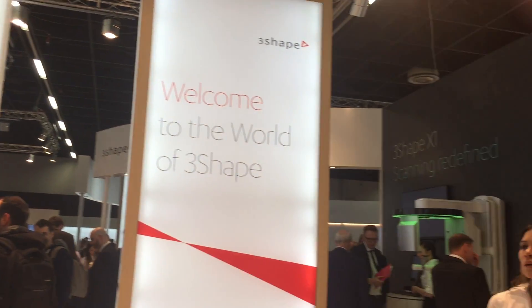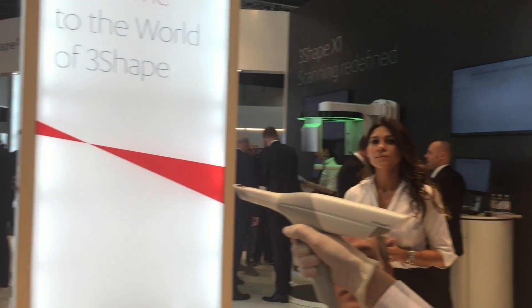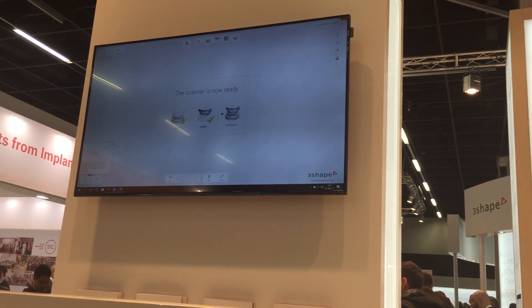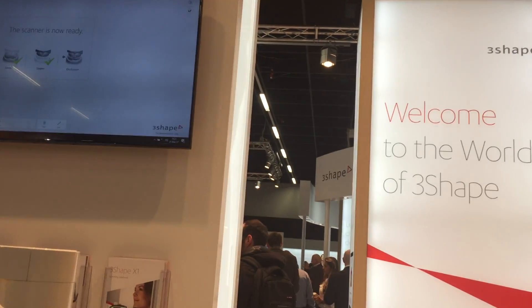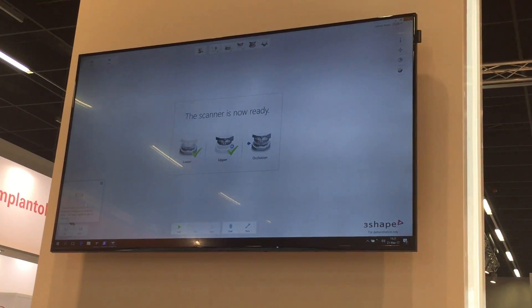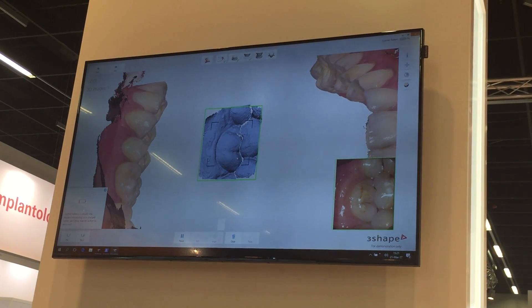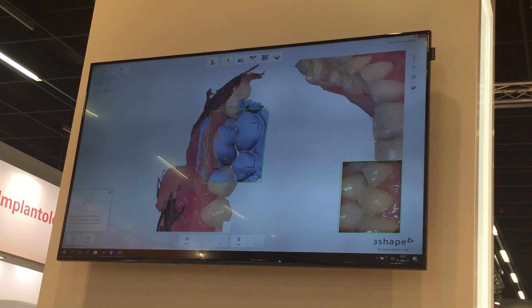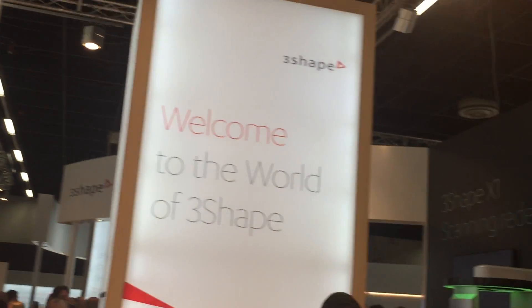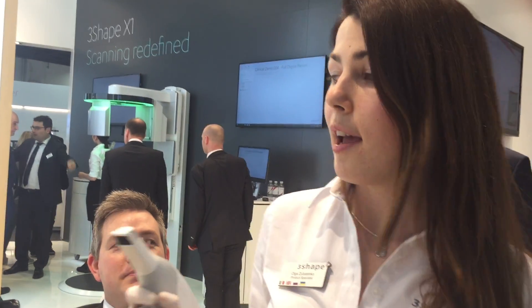So now we only missed the occlusion step. I have to scan two jaws together. I use my scanner to go to the next step and take the occlusion. And as you can see, in a few seconds the software automatically aligns the two jaws scanned in occlusion.